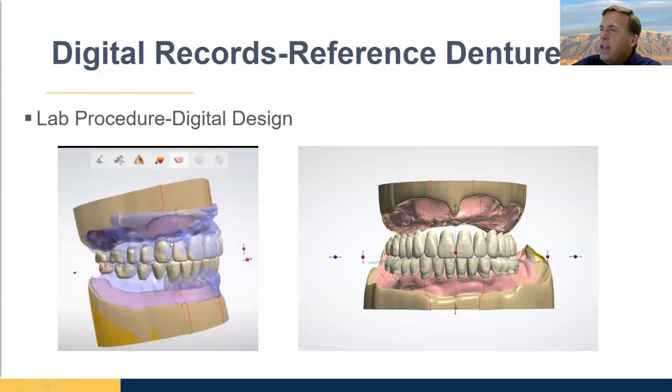And then see how you have this purple outline? This purple outline is the reference denture, or if we're doing a bite block, it's the bite block. As we're setting the new teeth, we can see exactly how those teeth relate to the existing denture or bite block, which can of course be very helpful. We'll want to position the teeth. One of the other things that's helpful about double arch denture teeth is that the teeth are imported in denture type occlusion for us. That way we're less likely to get interferences in the way the teeth are set, like we talked about last time.